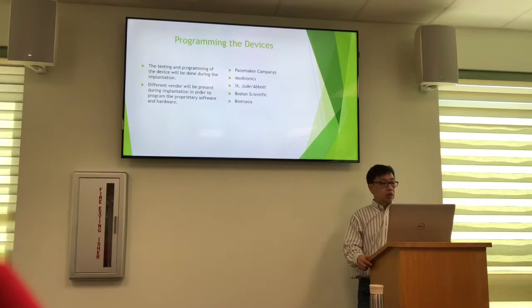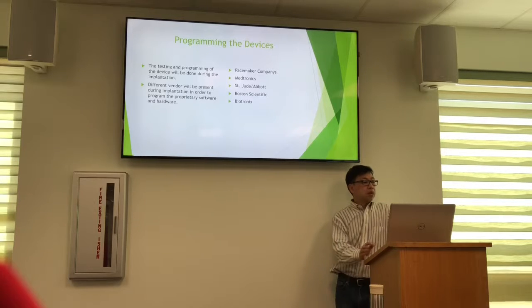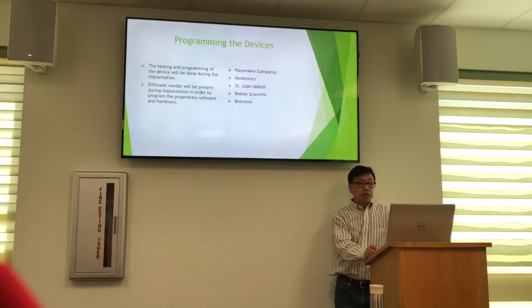Programming and testing of the device will be done during the implantation. A vendor will be present during implantation in order to program the proprietary software and hardware. Current companies providing equipment are Medtronic, St. Jude, Boston Scientific, and Biotronik.